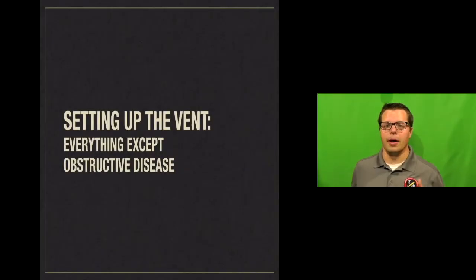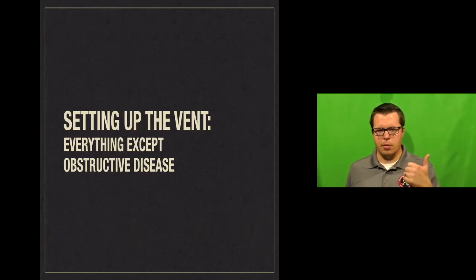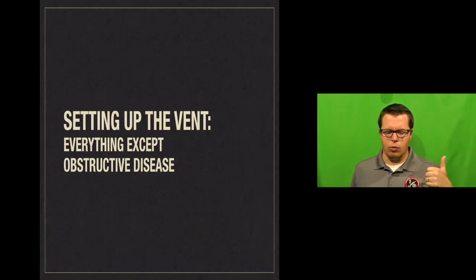So we've talked so far about what each of the different controls does. We talked about mode, tidal volume, rate, and oxygenation and how it's made up of PEEP and FiO2, and then we talked about the I:E ratio. And that's most of the knobs that you'll see on the ventilator itself. There are some other ones that you might run across, but that's the basic stuff, at least to get started with.